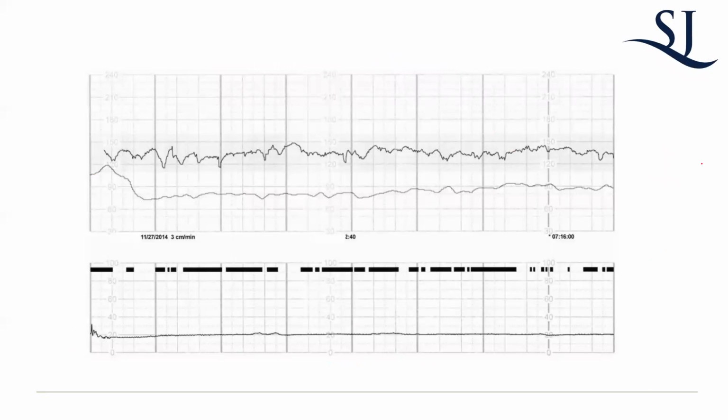So this is what a fetal heart rate monitoring strip looks like. Eventually this image becomes something that's easy to interpret. There are a couple of key things that I want to bring your attention to immediately. The first one is that this is the fetus's heart rate, okay? So that's the fetus here. This one here is the maternal heart rate. Now, the maternal heart rate should be less than the fetal heart rate, right? So the fetus is usually the first line.